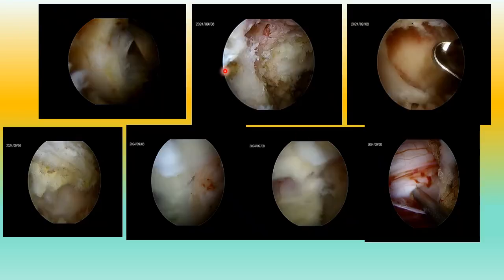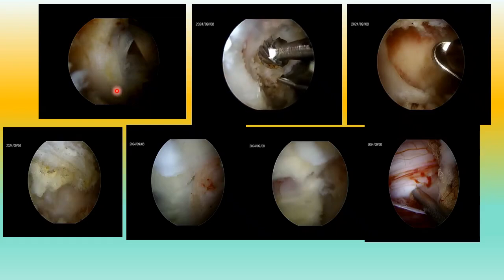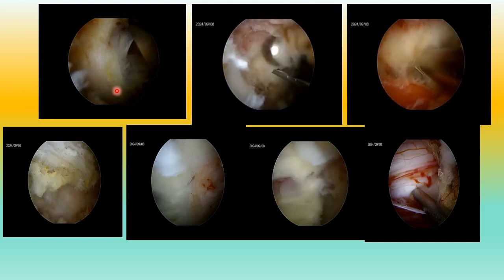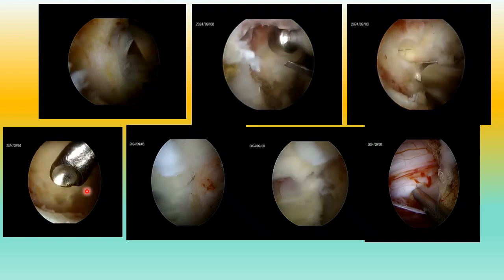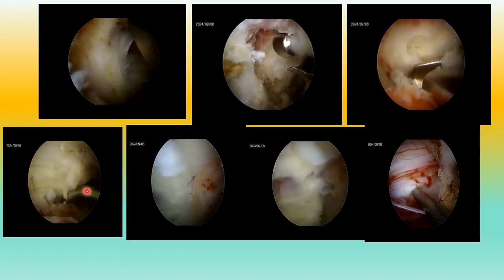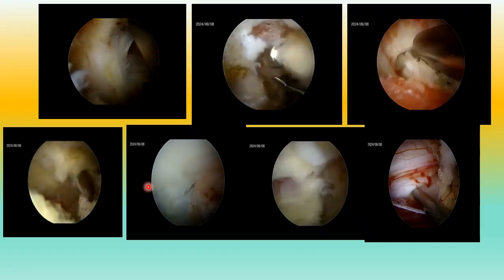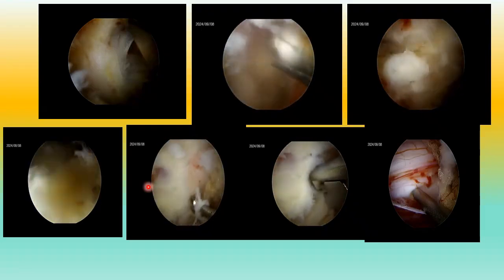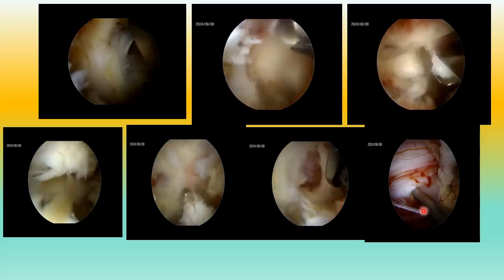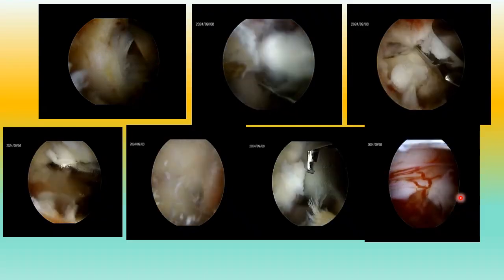So recap, this is how we drill, this is how we cut, and how we separate the ligament, all in one lower junction area working here, and discectomy.